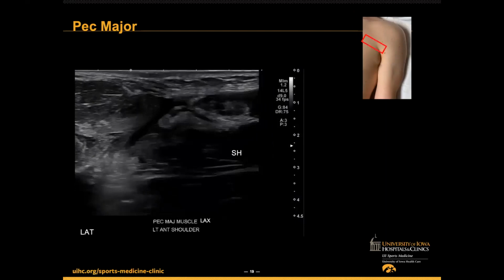So then we moved on to evaluate the muscles. We moved in long axis because, like I said, this is a tough area to keep your bearings. So making sure you know where the clavicular and the sternal heads are and moving proximally from there. So we did find an area of injury in the sternal head, just proximal to the MTJ. Here you can see an area of muscle tearing with hematoma, as well as some adjacent muscular edema and loss of muscular structure. The hyperechoic edema can be seen in the muscle here.